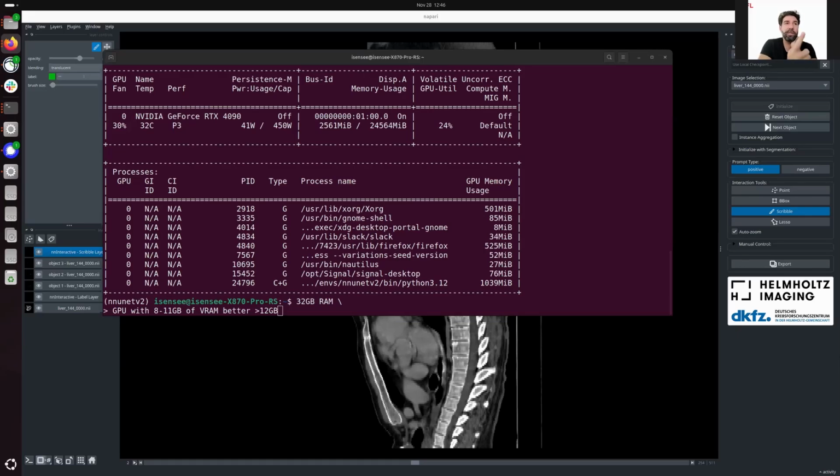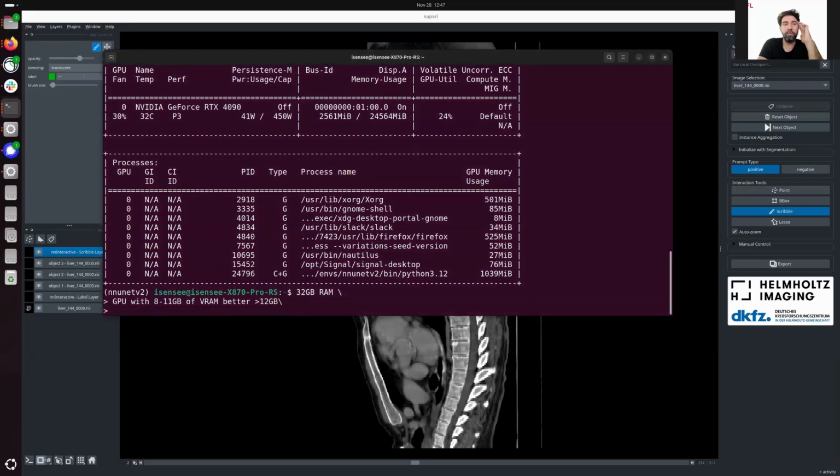But just to mention that on our wiki, maybe I will add the link in the chat, we detailed how to use it with a Conda environment and how to install. Also, we had an issue with the GPU 5090, which is a new architecture. Just to mention that to everyone, it's fairly easy and it goes very well.